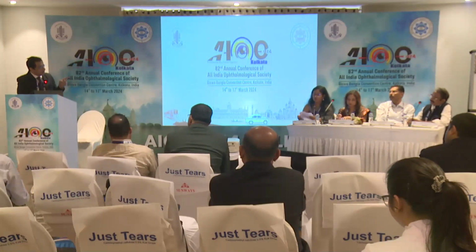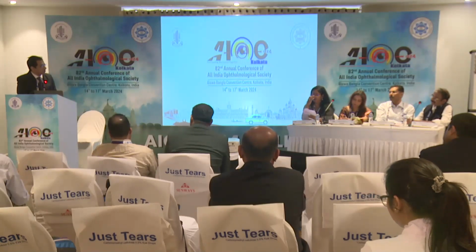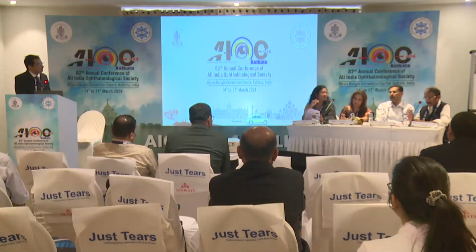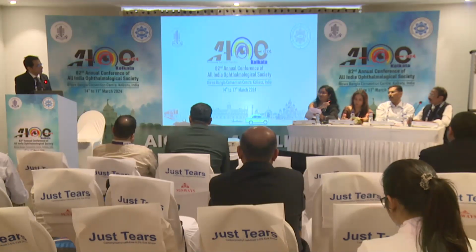And every hard eye intraoperatively need not be a fluid misdirection. So it is not wise to just poke in and try to be heroic and do an anterior vitrectomy, and it could sometimes be disastrous. That's the message. Wonderful presentation. The take-home message is never to poke; wait for some time, and then proceed. Thank you very much.